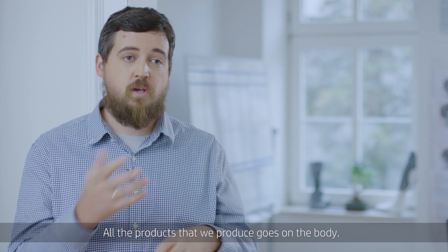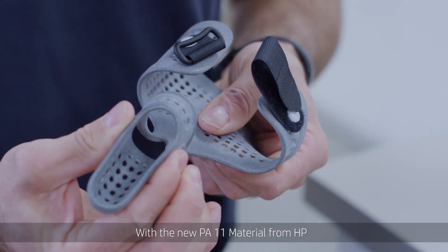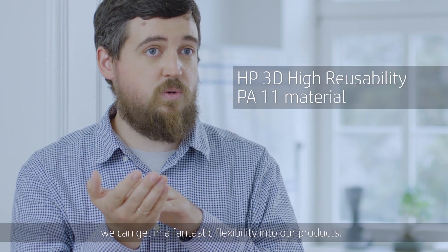All our products that we produce go on the body. The body is always moving. With the new PA11 material from HP, we can get fantastic flexibility into our products.